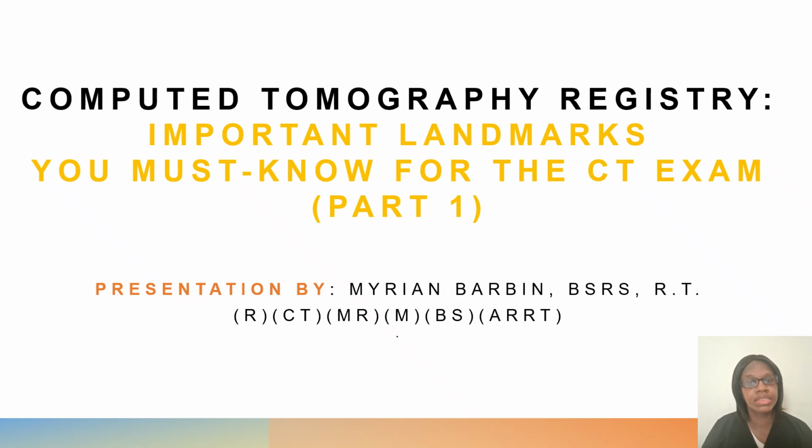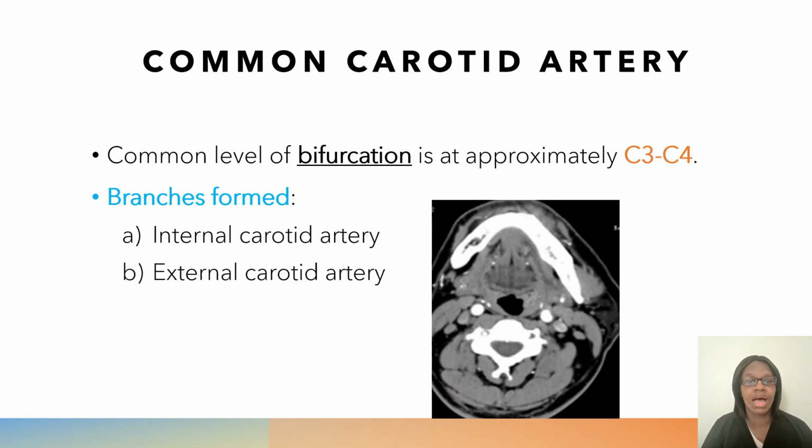In today's video, we are going to talk about the important landmarks that you must know for the CT exam. So this is just going to be a short video. This will be part one, unless you all want me to make another one where I'm talking about more landmarks. But this is very, very important for you to know for your test. I do have a lot of practice test questions mixed in between the lesson so that it can help you understand it. So feel free to watch the video as many times as you need to make sure that you know these landmarks.